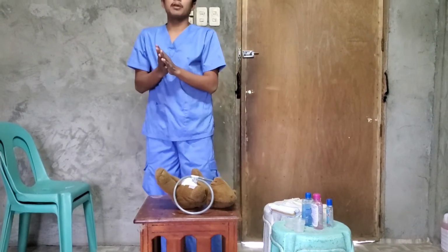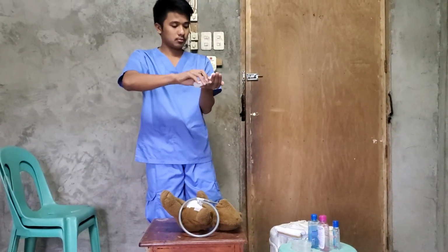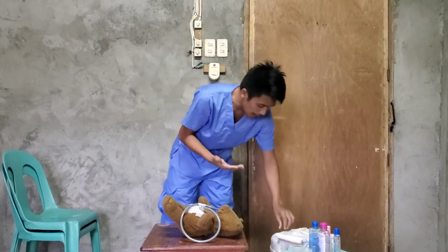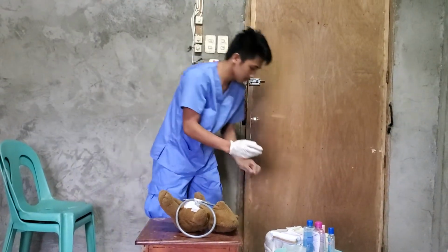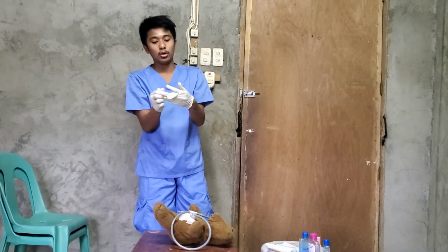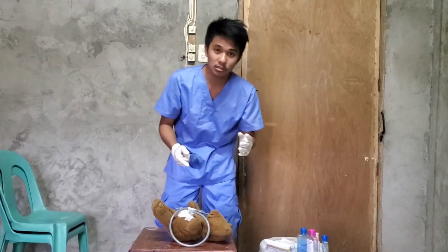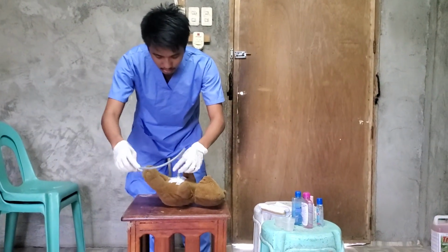Then after that is perform hand washing. After performing hand washing, next step is apply the non-sterile gloves. Then after applying non-sterile gloves, next step is you need to check the placement of the gastrostomy tube.